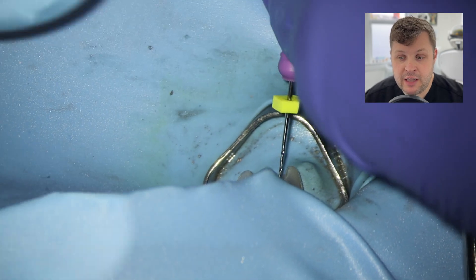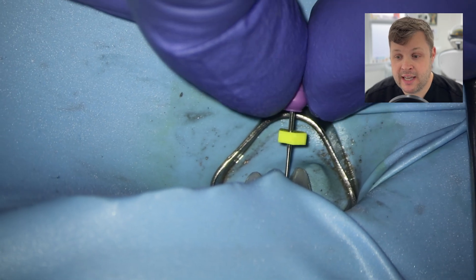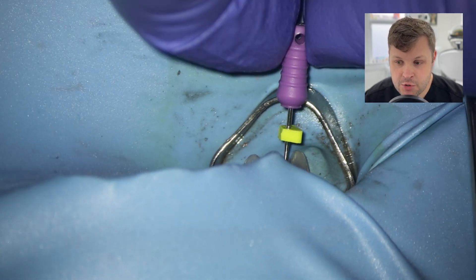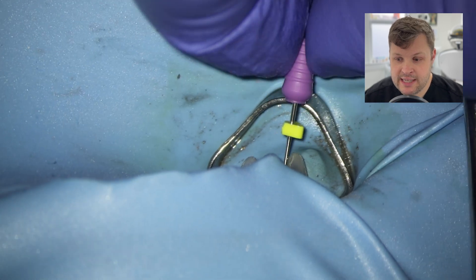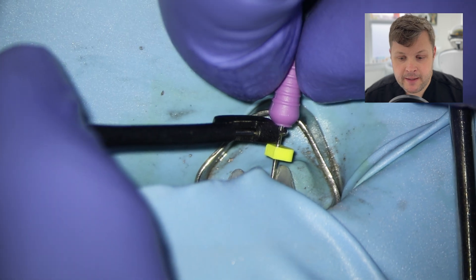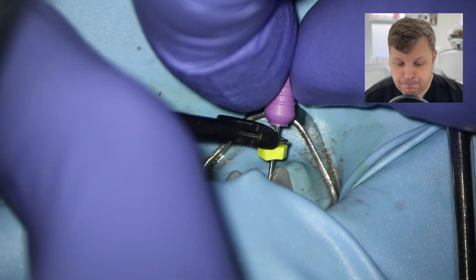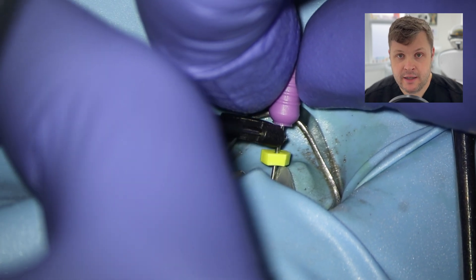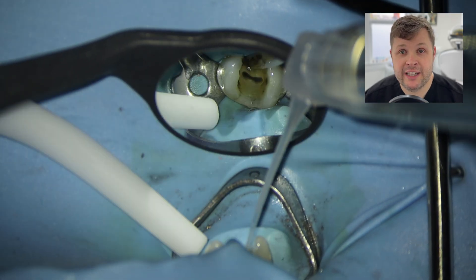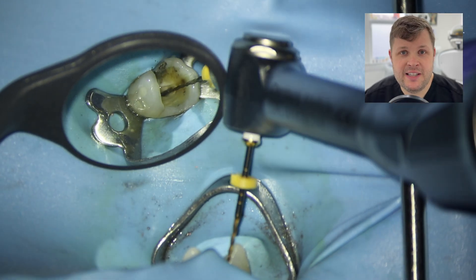Once the size 8 is nicely to length, I increase diameter and use a size 10 file — shaping to zero, not through the apex. I keep rechecking the working length because for an accurate reading you need a file diameter that fits the apical diameter as closely as possible; a smaller file that just pushes through won't give you an accurate working length. Then we're ready to shape using the size 15 HyFlex glide path files.